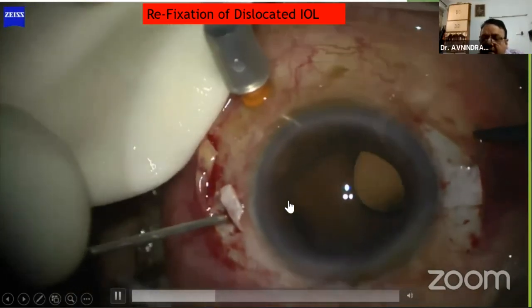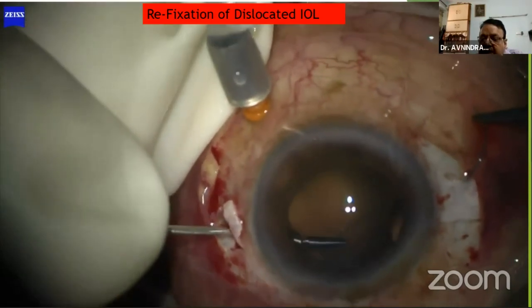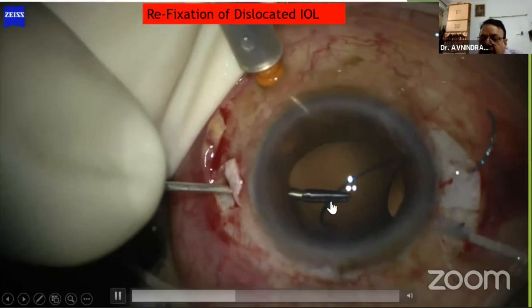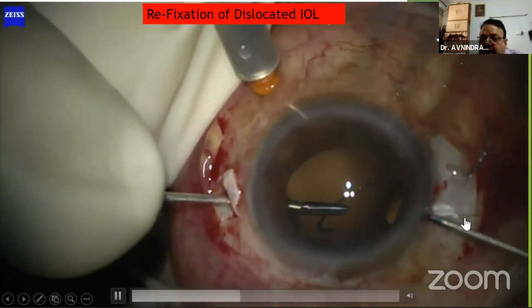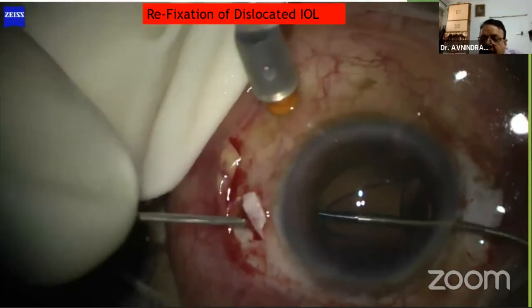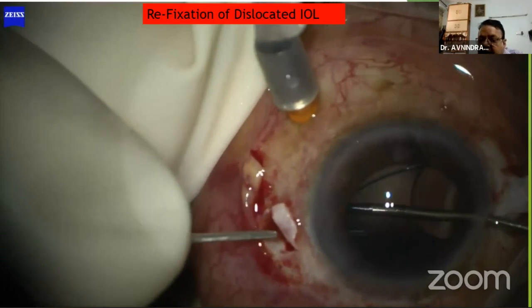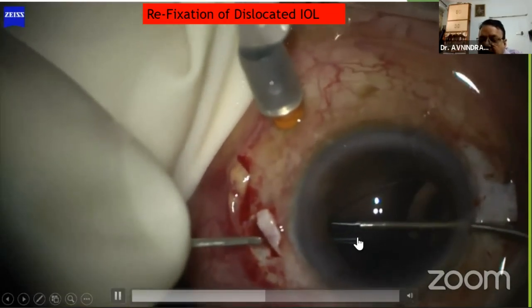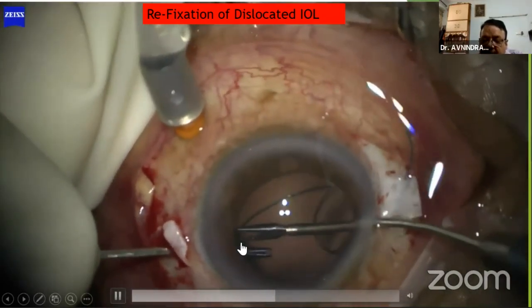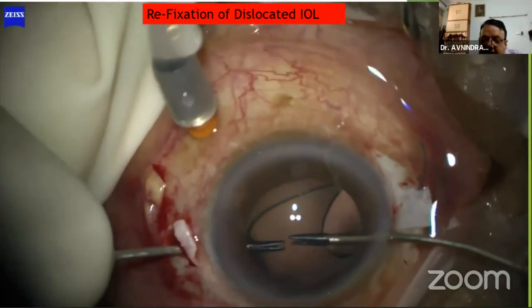Sometimes it becomes very difficult to hold this haptic. So what we do is a handshake technique: hold the haptic with one forceps, the other forceps is introduced through the paracentesis, and then hold this haptic. The second haptic is also held, and this time you hold the haptic from the tip. So while externalizing, you won't kink or break the haptics. Once the haptic is held at the tip, it is externalized.